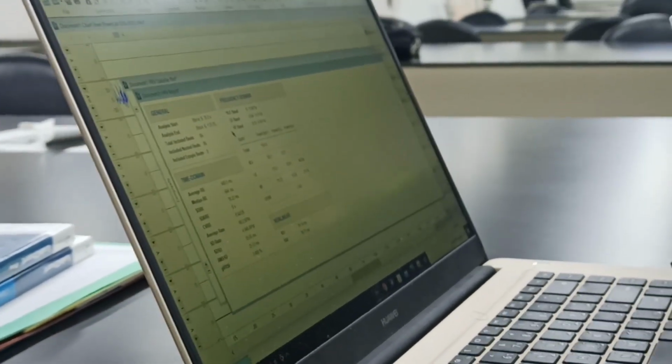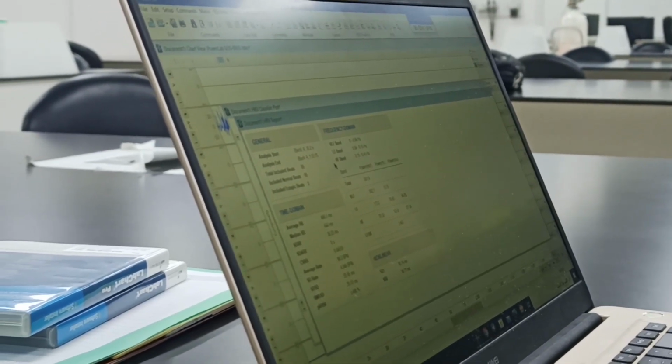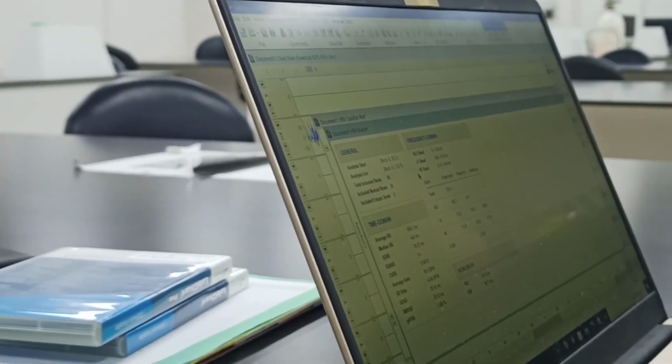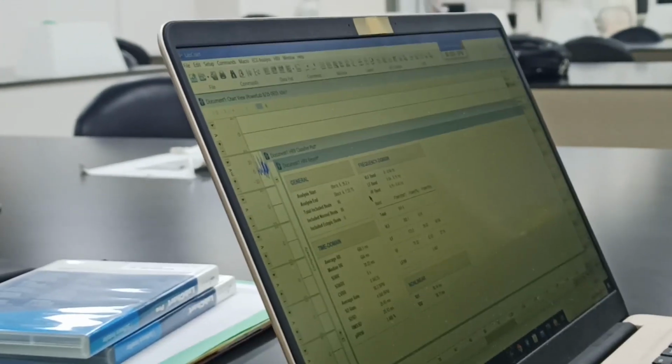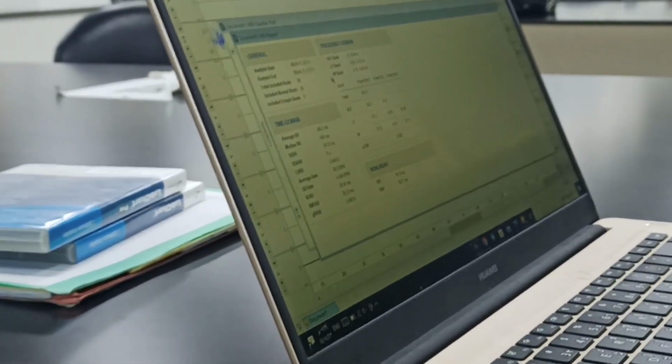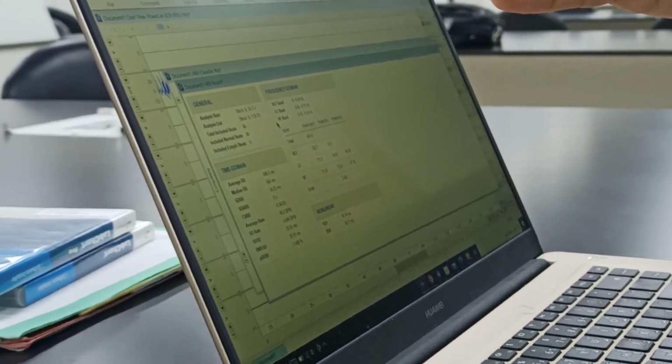This gives you an idea of the overall variability of your pulse. The greater the variability, the better it is. That is the usual case in a normal person. If my heart rate is too fast, you will not see much variability. If my heart is slower, you will see greater variability.